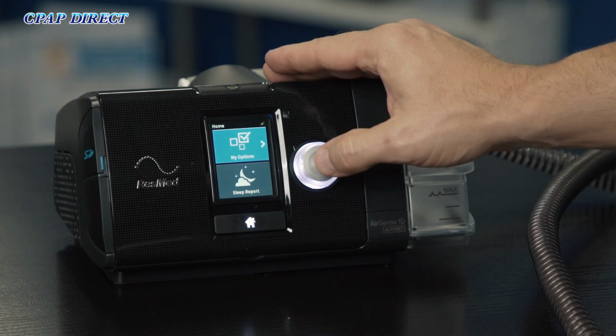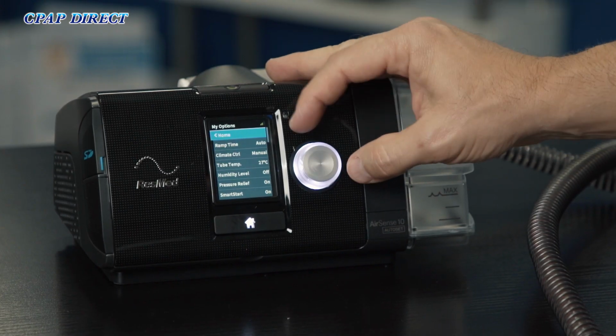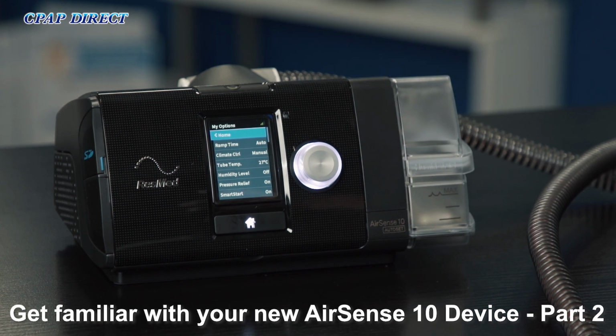So we'll go through navigating the menu now. On the front of the screen, you'll see the My Options and the Sleep Report settings. So if you press the scroll dial button to go into My Options, the first thing that we should be looking at is the type of mask.